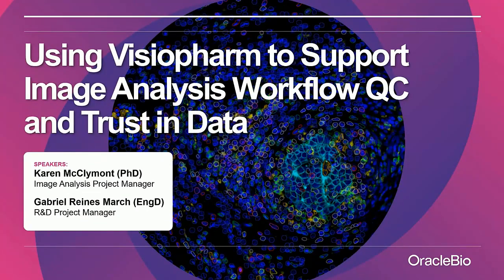Thank you for the introductions. I'm going to start by giving a brief overview of OracleBio, who we are and what we do, before we move on to discuss a couple of case studies where we'll go into more detail on how we use Visiopharm to support our image analysis workflows.